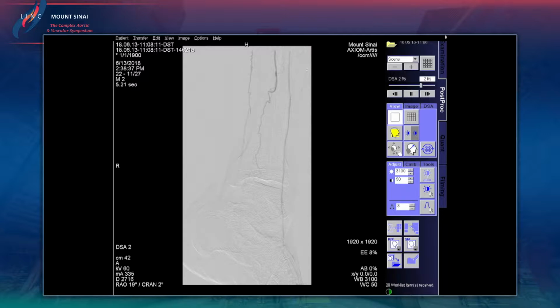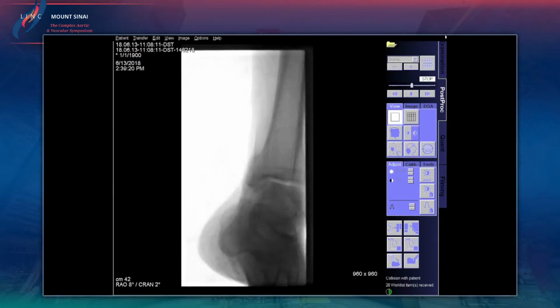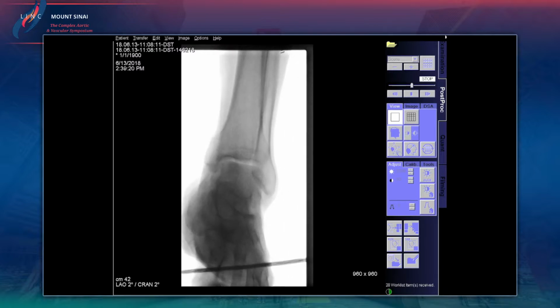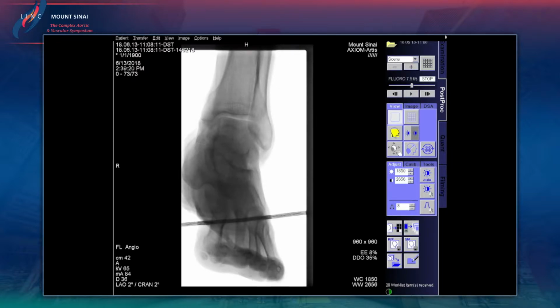I personally think if you get the forefoot in that image and that arch is class 2A, meaning it's being fed from the anterior tibial, and you see that there's a blush distally into that first toe, I would feel very comfortable not necessarily going after this. What is this thing in the EKG? Can you move the EKG lead, guys, for us? Carefully. So yeah, I would feel comfortable just focusing on the anterior tibial. There's too many small, squiggly collaterals. There's no nice plantar. It may not be there, or it may light up once you get the AT open in a retrograde fashion. So I would not have concerns in just going for the AT initially.